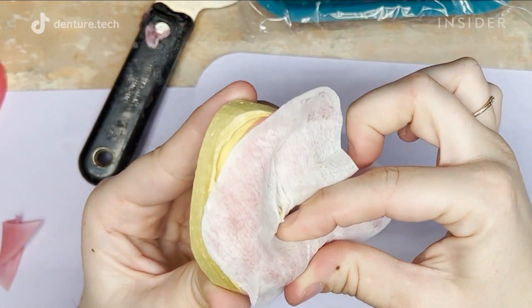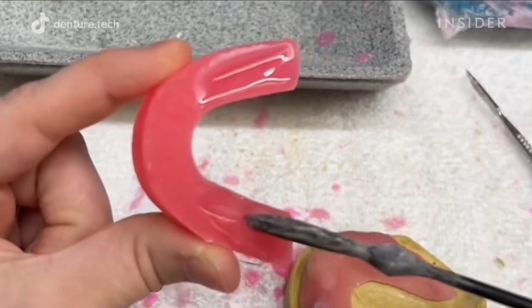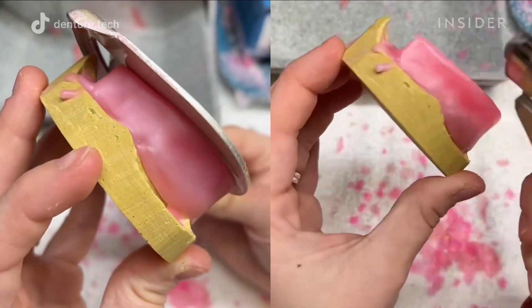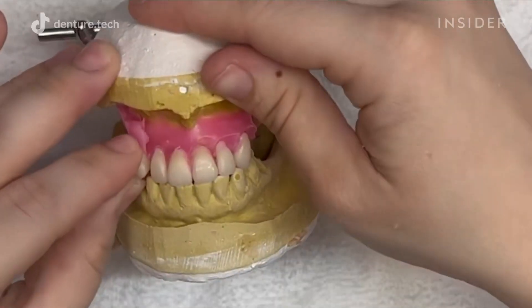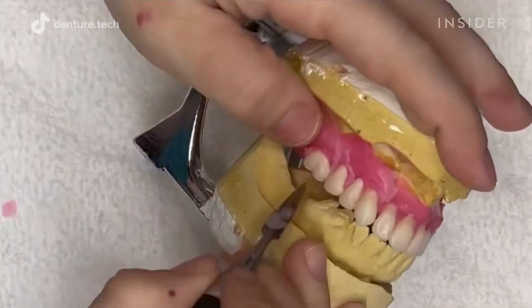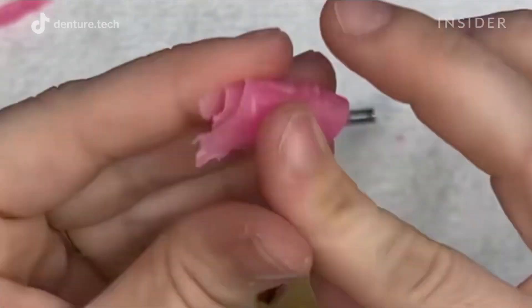A wax bite block is made to register the client's bite and how close their jaw is. The model can then be transferred to a device called an articulator, which will help map the patient's correct bite position as well as normal jaw movements. The fake teeth are also attached to the wax bite during this step.